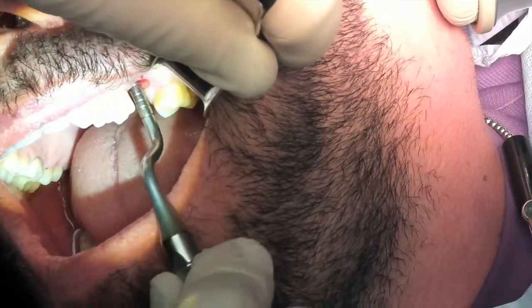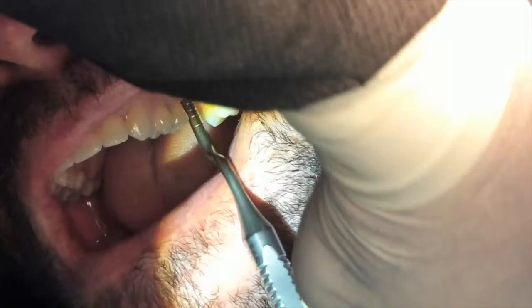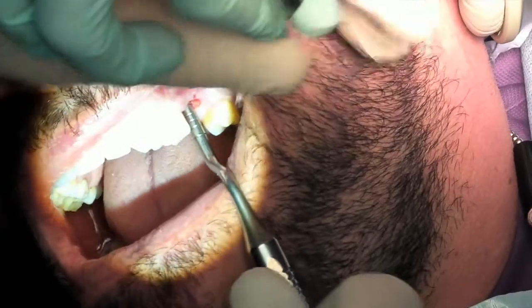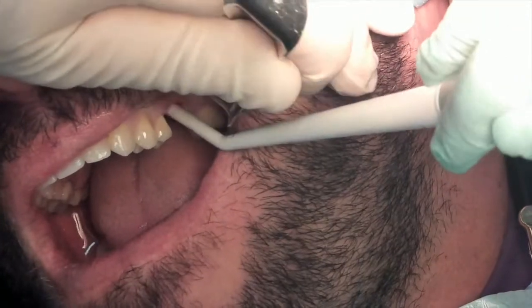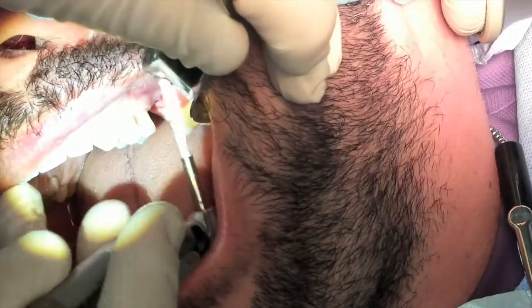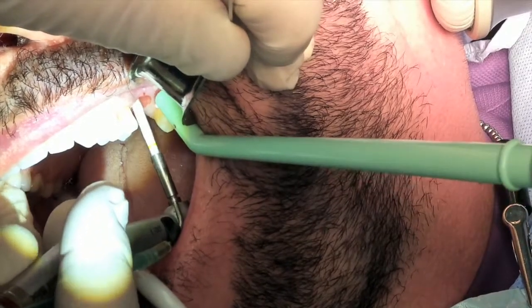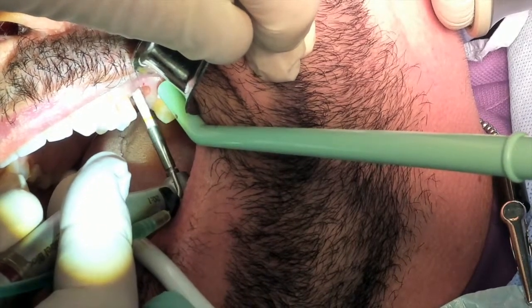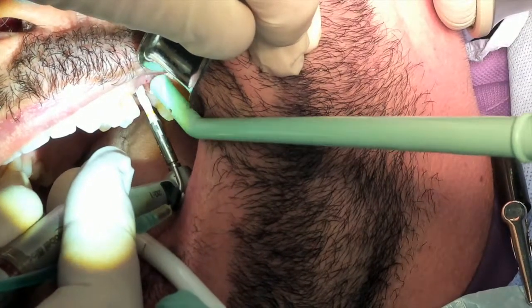I'm going to go all the way. Matt, you take this? Another little tap, okay? And we're going to go one more little tap. Sorry about this. Great. The septa are a little bit more challenging. We're going to go back with our 2.8 drill again. And I'm using just a little pressure, a little bit at a time. And you can see we're pretty much right at the 10 spot.